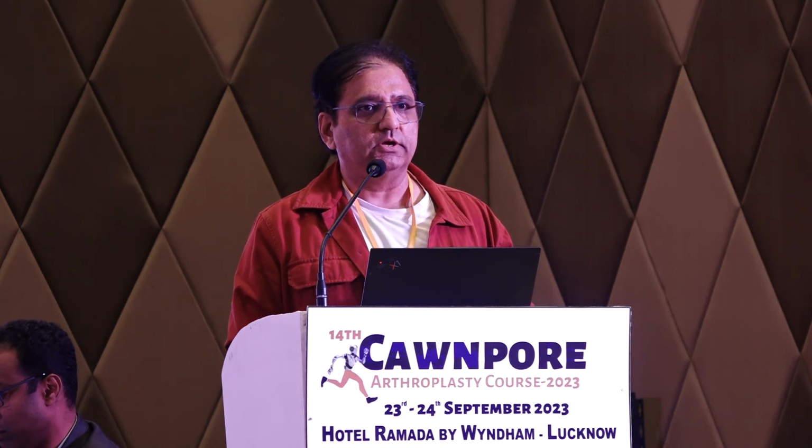So let's give the patient the native alignment. Let's try to maintain the joint line obliquity. We used to say knee replacement is a soft tissue surgery, but now we are not doing anything to the soft tissues. Everyone doesn't want to touch the soft tissues. Previously, we were balancing everything to the soft tissues. We want to match the implant as perfectly as possible to the patient's anatomy so that patellofemoral problems are not there, and we want to balance the knee in flexion and extension.